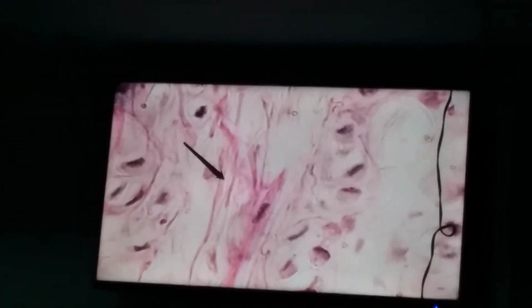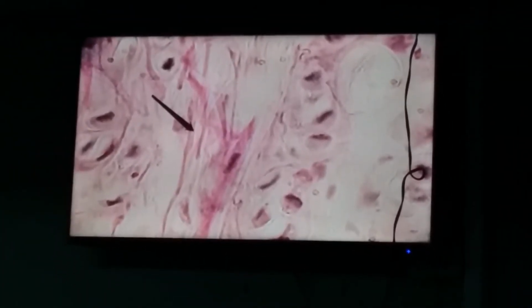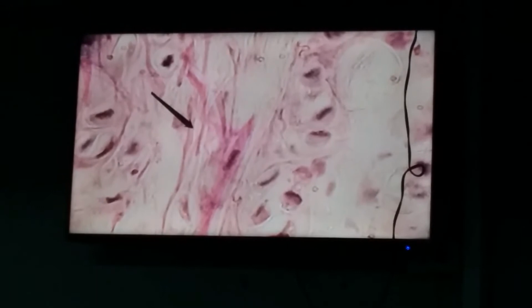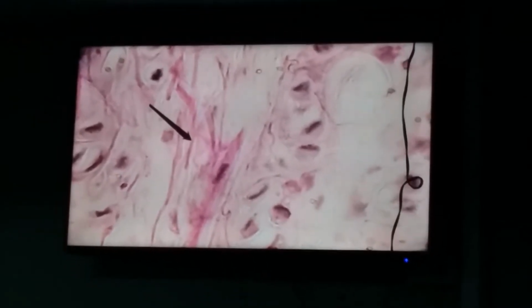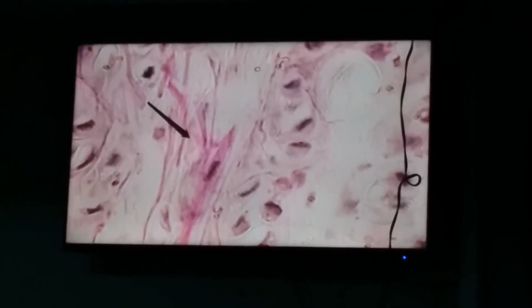Again, this is your epiglottis. My clue here is that the organ in focus is E, epiglottis. This type of fiber is E, elastic fibers, and this type of cartilage is E, elastic cartilage. Okay? So again, what is the organ of focus, class?